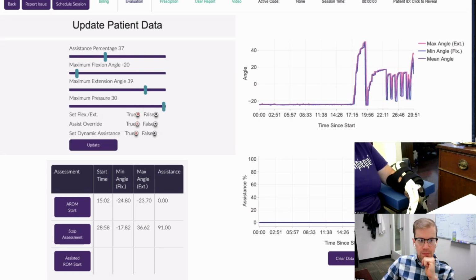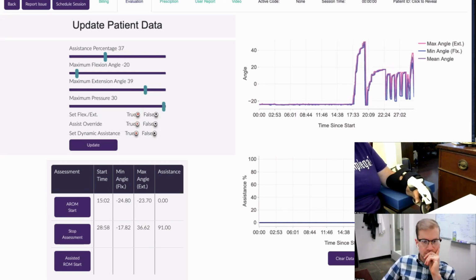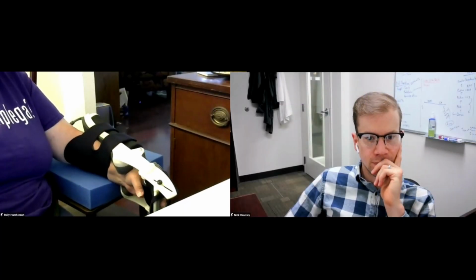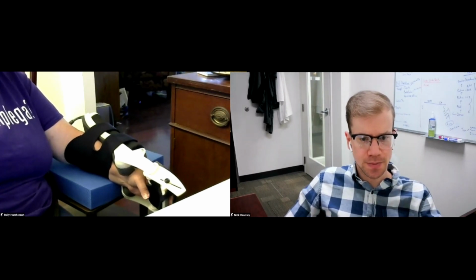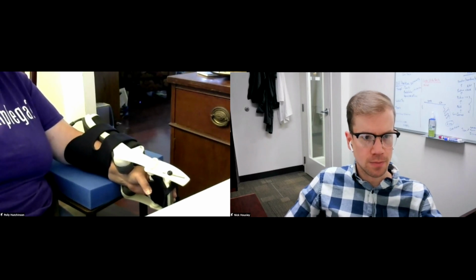What are the maximum values? Yeah, so 25 into flexion and 55 up into extension. So I'm really happy. Yes. Yep. Okay.